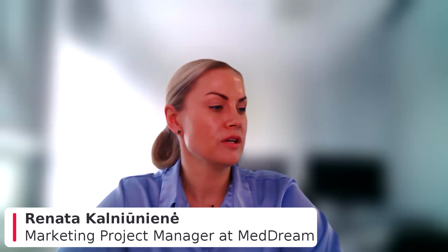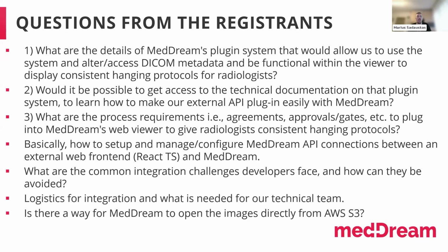Okay, now you should see. Yes, it's coming. Okay. So first, what are the details of MedDream's plugin system that would allow us to access DICOM metadata and be functional within the viewer to display consistent hanging protocols for radiologists?